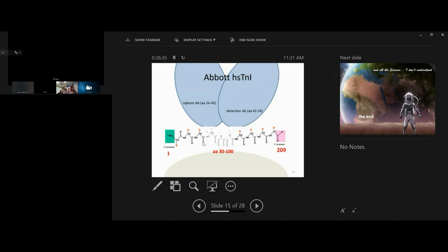So if you want an alternative troponin assay that's less likely to pick up macrotroponin, then you could try one that doesn't claim to be high sensitivity. Of course, all the lab assays now are high sensitivity, but we still have point-of-care devices that aren't, like the Roche point-of-care troponin T I mentioned in the St Vincent's case at the beginning, or our own iStat. And it does seem that these assays from an older, simpler time just can't see macrotroponin. Maybe it's because their antibodies bind at different sites, although that doesn't explain the Roche example. Maybe the antibodies just aren't strong enough to be able to kick off the patient's antibody. Maybe there's something special about how point-of-care devices work.